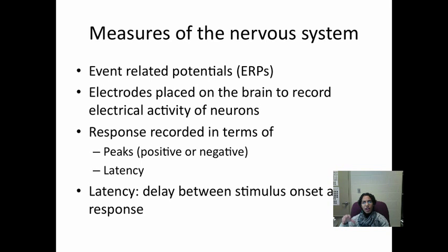Now the response is recorded in terms of two things. One is what kind of peaks you obtain, whether it's a positive peak or a negative peak. You'll see it as a waveform, and you'll see the peak being positive or negative in the waveform. The second one measured is the latency. What is latency? Latency is defined as the delay between the stimulus onset and the response.